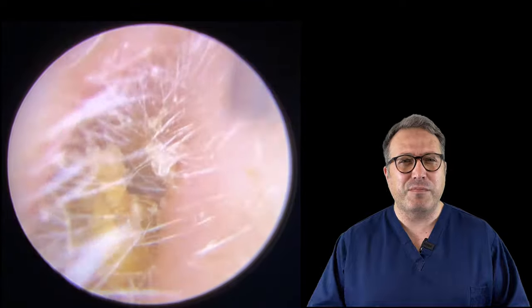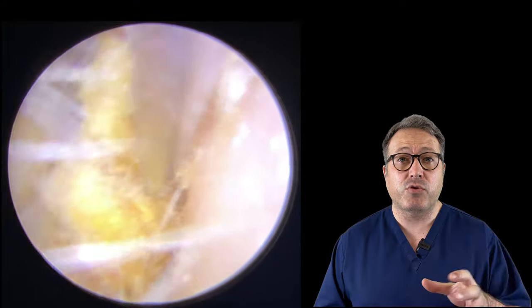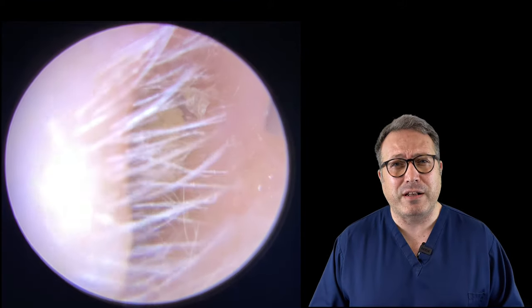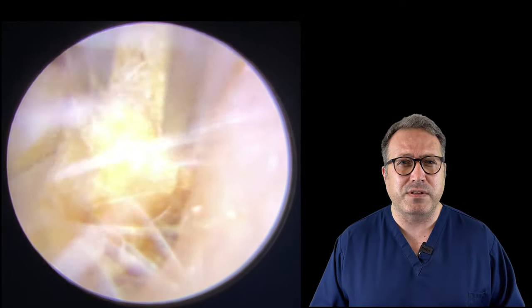So you can see we've managed to pull a long thin strip of this tissue paper away. We're just going to go in with the crocodile forceps now, just to try and clamp onto this tissue paper and draw it out of the ear canal. You can see it just tore a little piece away there, so we'll go back in and see if we can grab another section of this tissue paper.